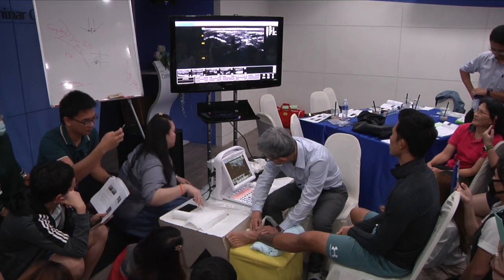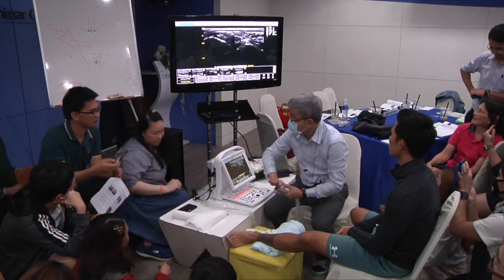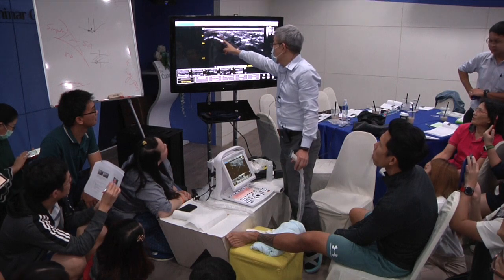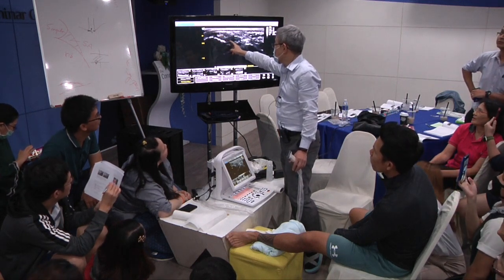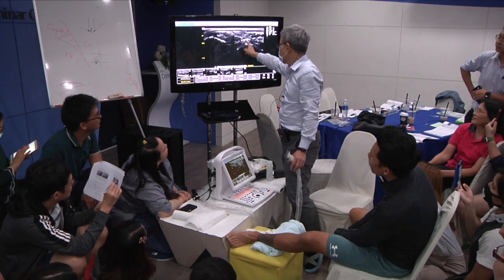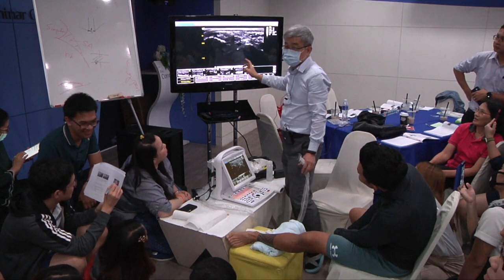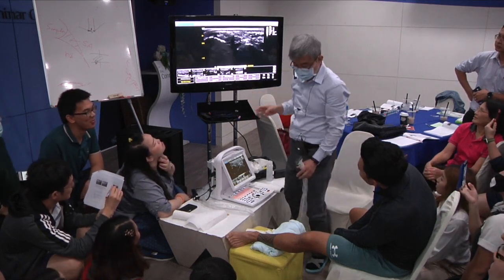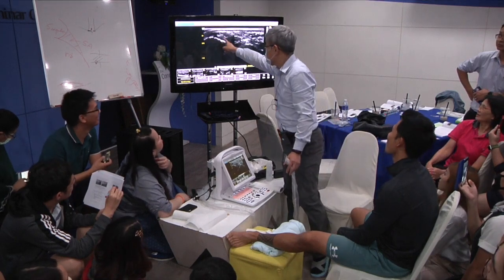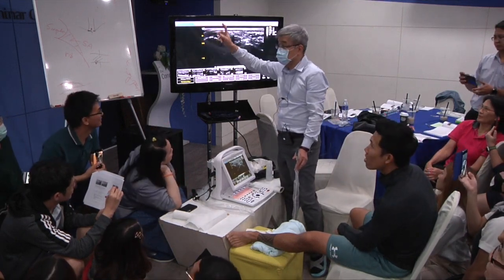Okay, freeze. Tibia posterior, flexor digitorum. Artery, vein, nerve. Somewhere in here. No, because the window is not wide enough. But it's okay. No problem, right? Tibia posterior. Flexor digitorum tendon.